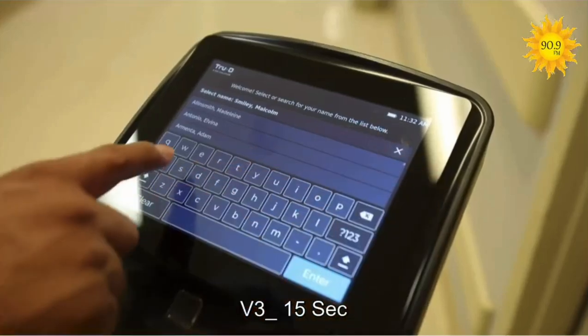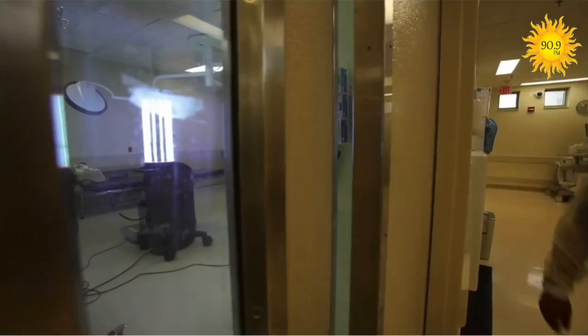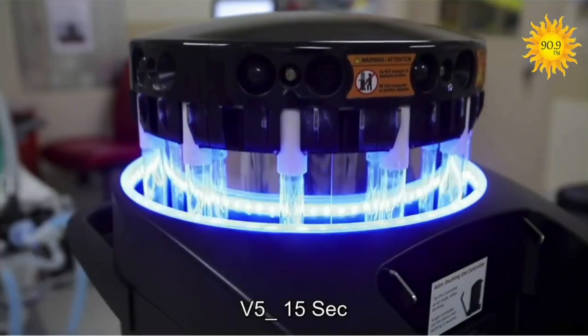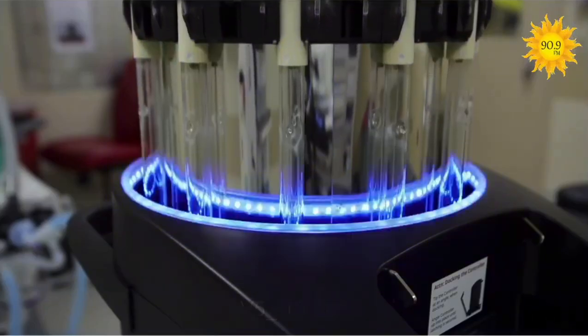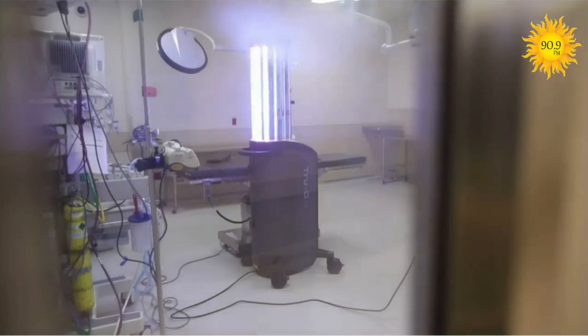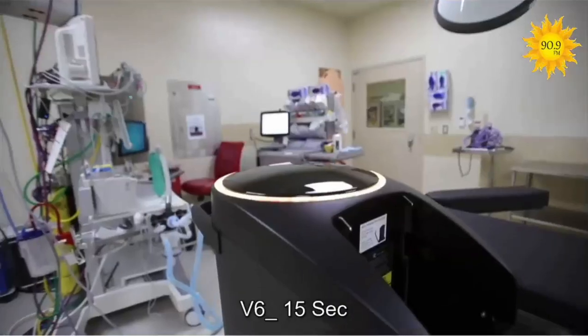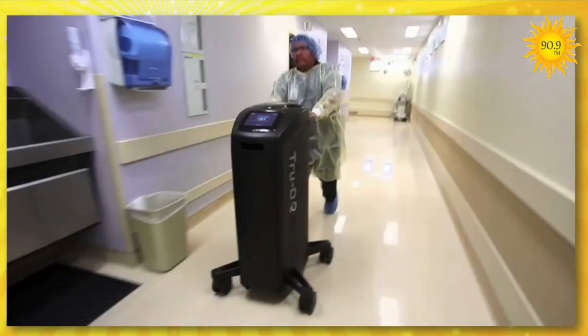Gotcha. And how it works is that it uses UV technology. Ultraviolet. And it takes bacteria and microorganisms, and it breaks them apart so they don't regrow, so it's not infectious anymore. It changes the structure of that germ. Interesting. And so it's actually cleaning the air in the room, right? It's not scrubbing the floor. It's not like a giant Roomba or things like that. It is really just specifically cleaning these viruses and things that could be in the air. Is that the idea?